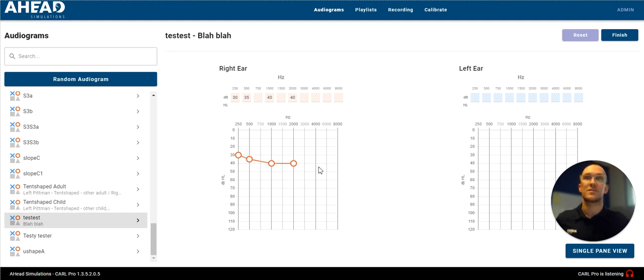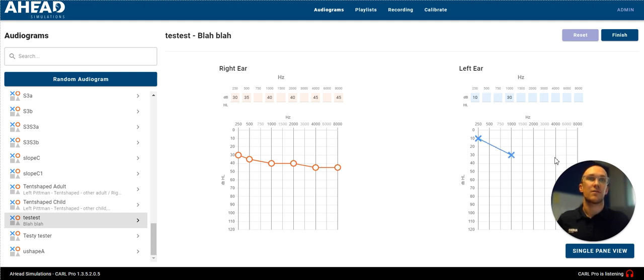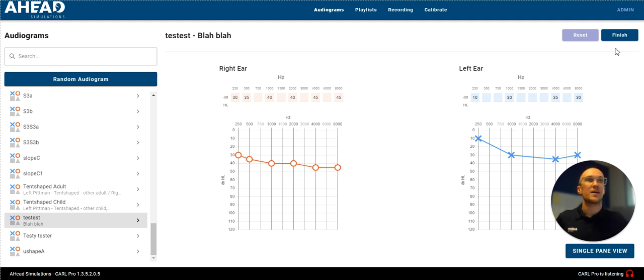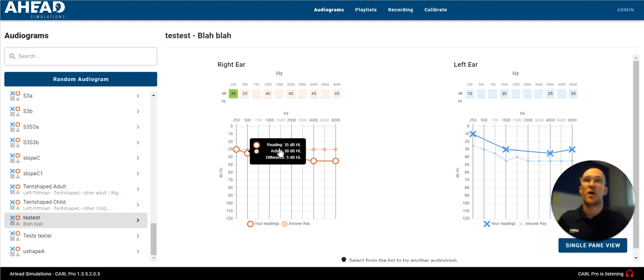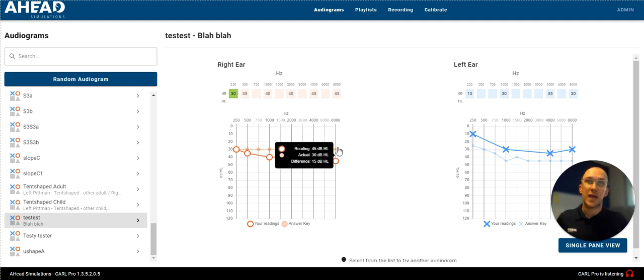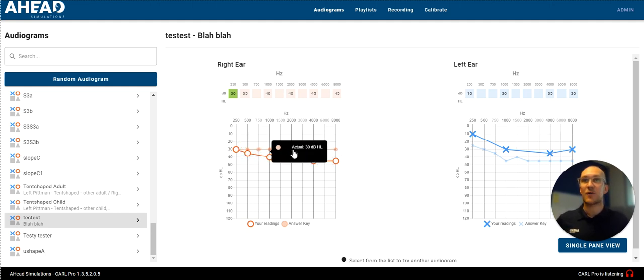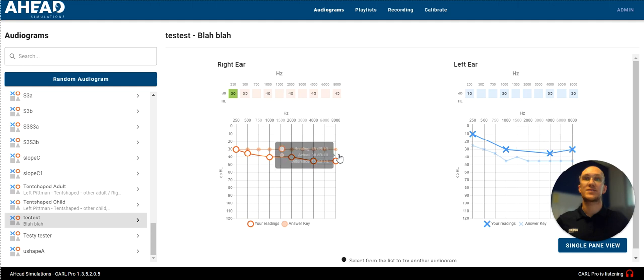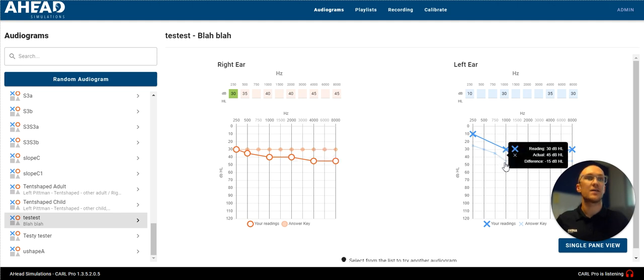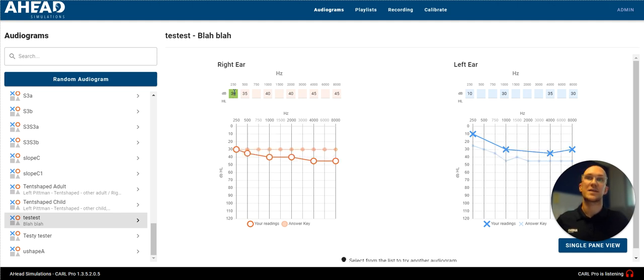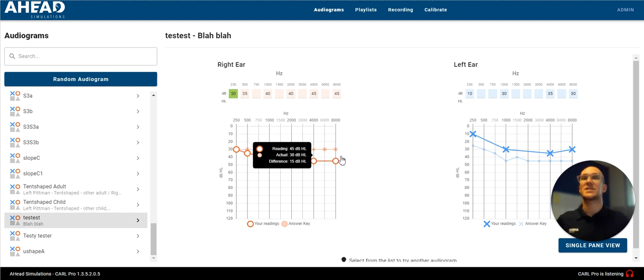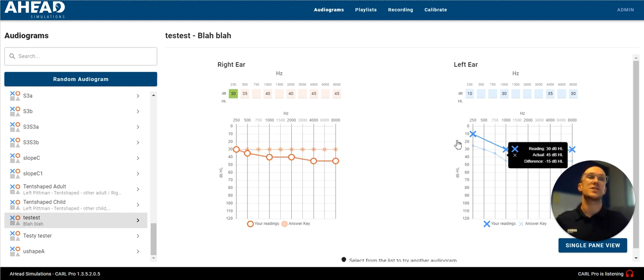I'm going to plot them on this graph. Here we go. I got really lazy on the left ear here. And then when I'm done, I can click finish and it will show me what was the actual case that was given to Carl and what were the values that I read. And you can see we were unfortunately only correct at the one frequency. And this was the same case that we just created.